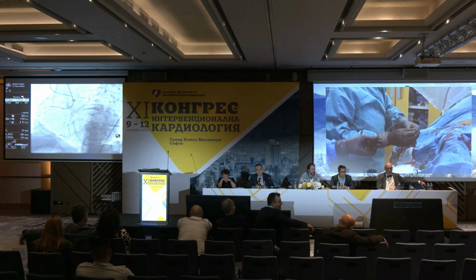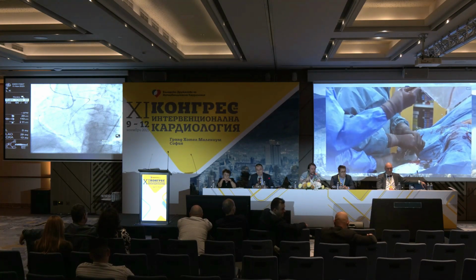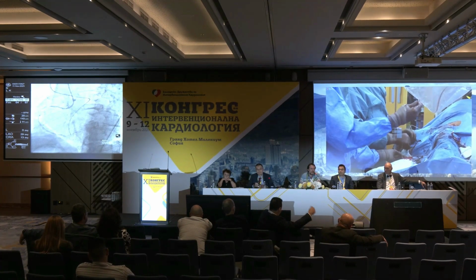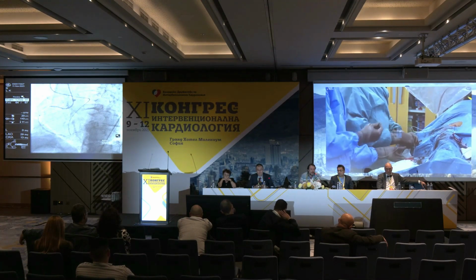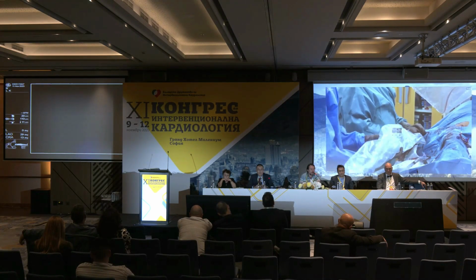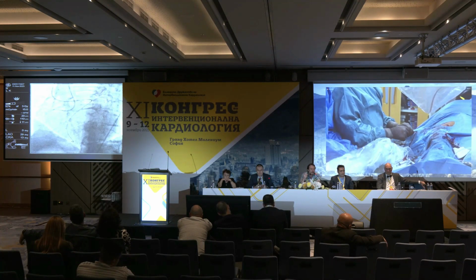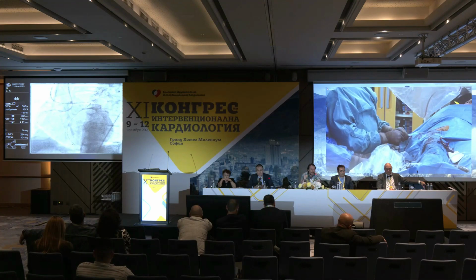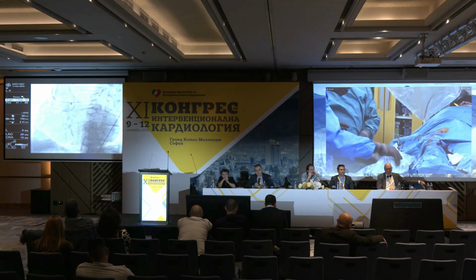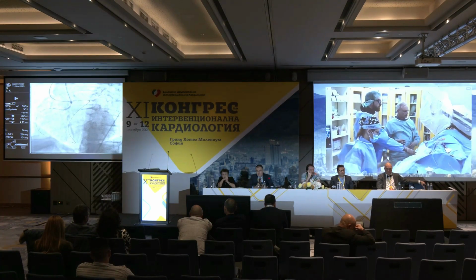Well, let's see what the IVUS will show as far as we have time for that. As George pointed out, he is totally right. Sometimes, even if we want to prepare the vessel antegrade, we don't know where to go. And sometimes you don't have the support to knuckle. Even if you scratch with Confianza, you don't know where to go, and you still need some guidance to knuckle down. So then we go retro, as George has done. He didn't need any antegrade vessel preparation. He has done it retrogradely, and it was masterfully done.